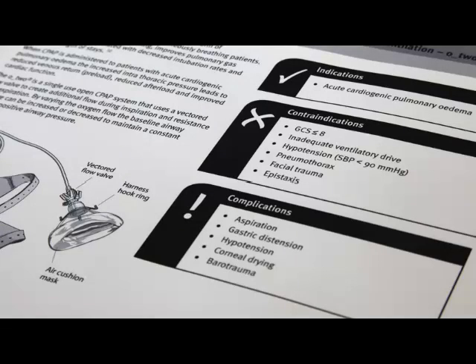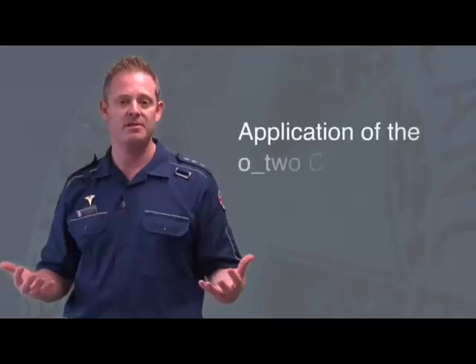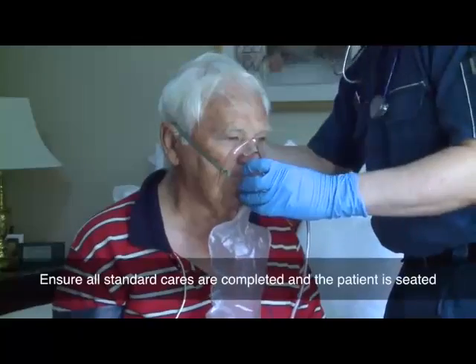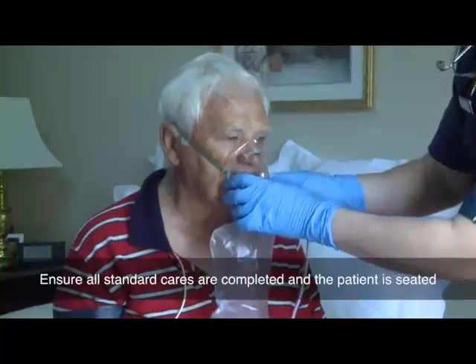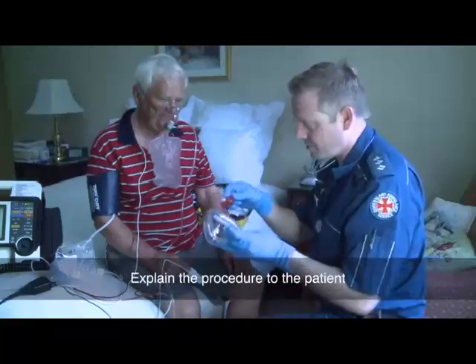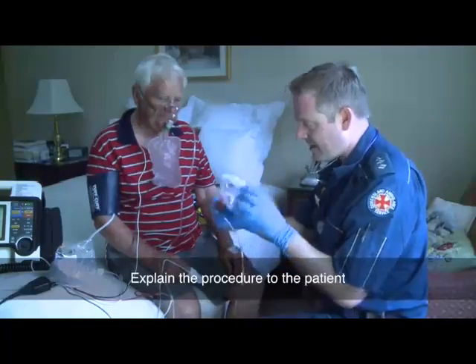Let's now look at the practical application of the O2 CPAP device in the field. Ensure all standard cares have been completed and ensure the patient is in a seated position. Explain the procedure to the patient, as patient understanding and cooperation is essential for the success of CPAP.